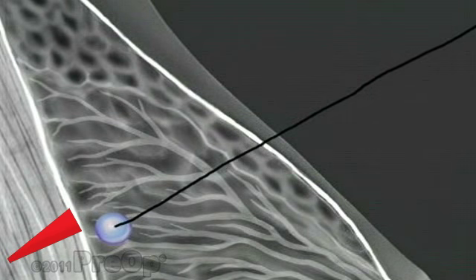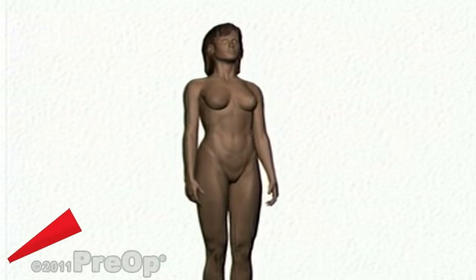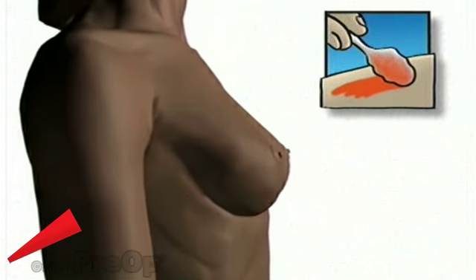The radiologist will perform another mammogram in order to verify that the wire has been placed correctly. It is possible that the wire will have to be moved or repositioned, and a mammogram taken once again. You will then be transferred to the operating table. Your doctor will scrub thoroughly and will apply an antiseptic solution to the skin around the area where the incision will be made. Then the doctor will place a sterile drape or towels around the operative site.